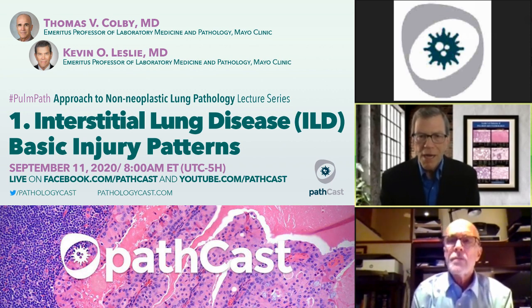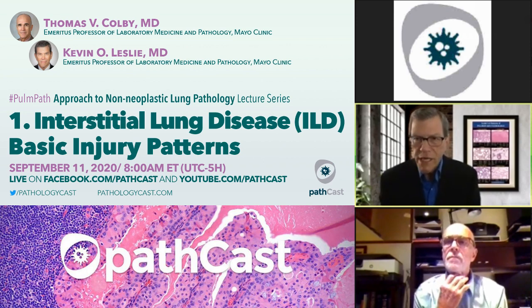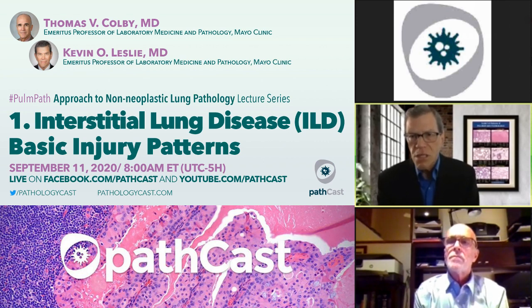Then look for other things in the biopsy, like the presence of granulomas, the presence of fibrosis in the background, or honeycomb change. So there is an order to things, and in the poster, I tried to order it like this. Acute injury, pattern 1, leads to organization, airspace filling, which is pattern 4. Pattern 4, if left untreated, will evolve to pattern 2, fibrosis. So acute injury, subacute injury with organization, and fibrosis are the 1, 2, 3 patterns. That's the way to think about it and focus, in my view.